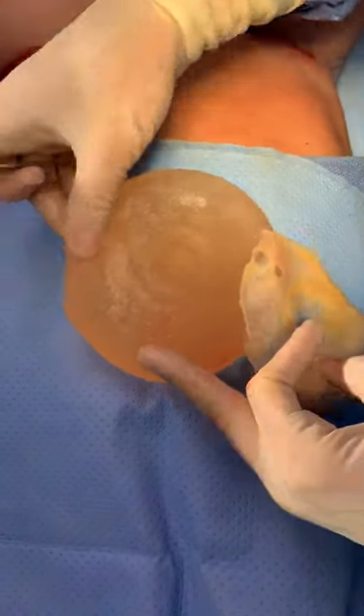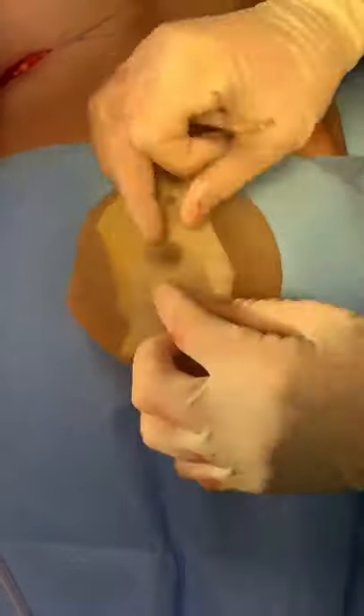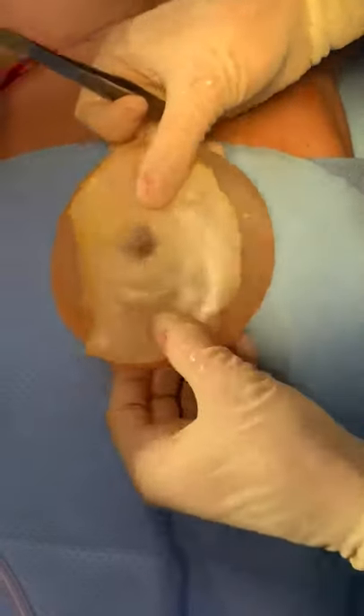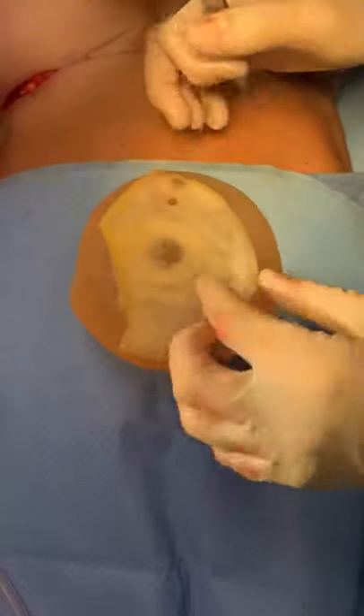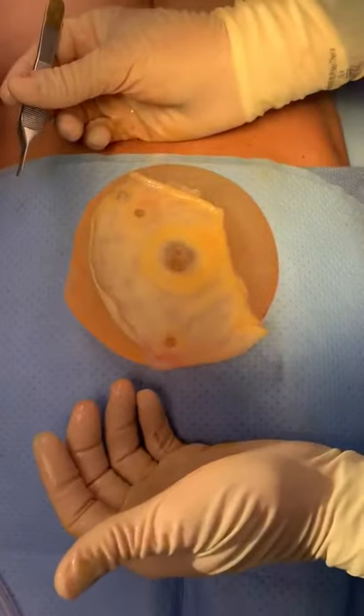While that velcro texture was helpful to get implants to stick and stay in position, it didn't always work because sometimes you get a double layer that would stick to the implant, making it essentially a smooth implant against the scar tissue inside the body. This can create thickened additional scar tissue that is not desirable.